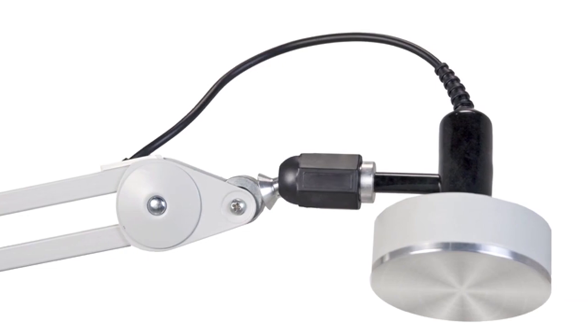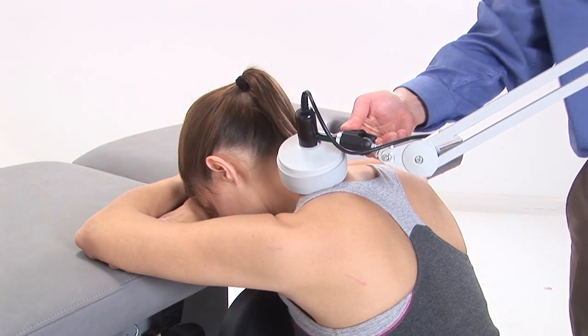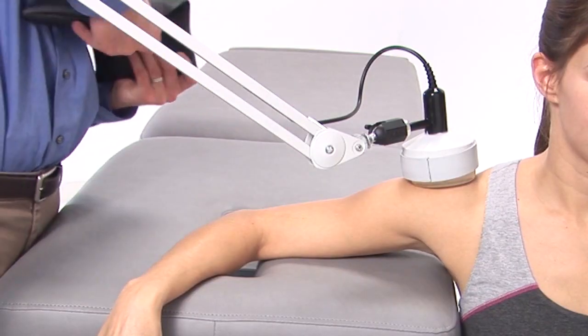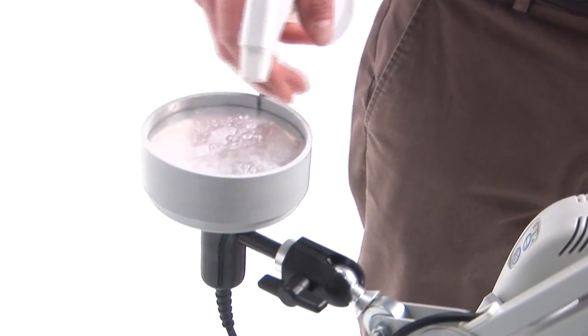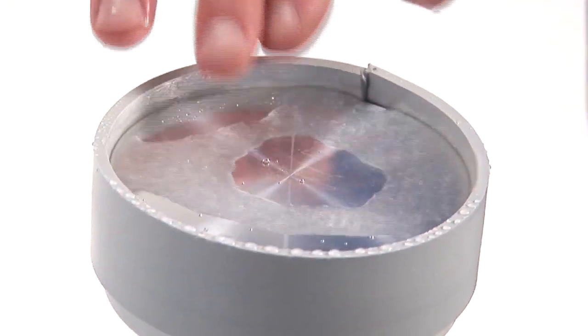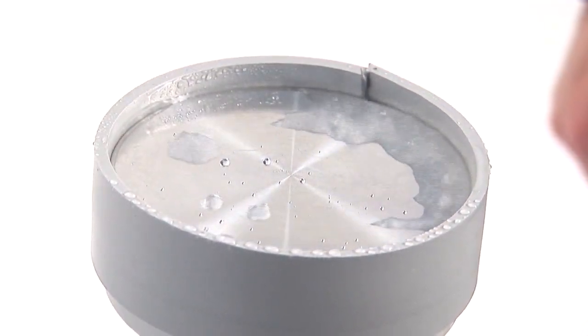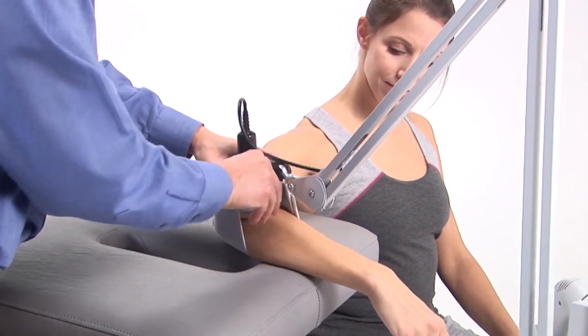Unlike a conventional sound head that has to be moved continuously, the HF 54 disperses the intensity over a large area to deliver ultrasound at a safe, effective, and calculable rate. Each sound head is engineered with three piezoelectric crystals that are harmonically set to operate as one large crystal. The sound head is mounted on a universal joint for perfect positioning.